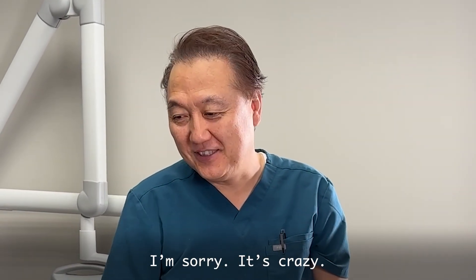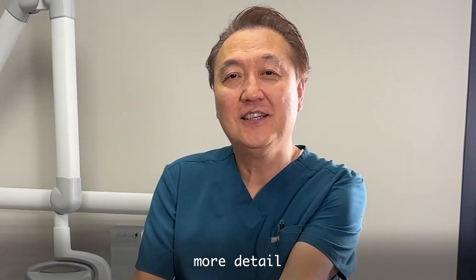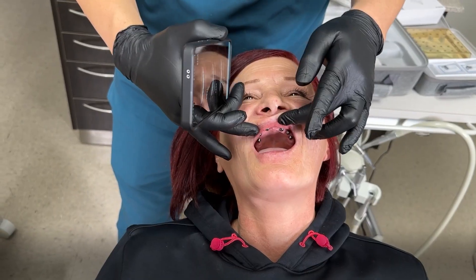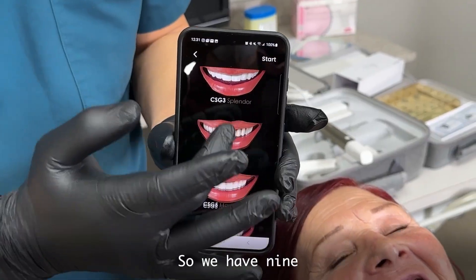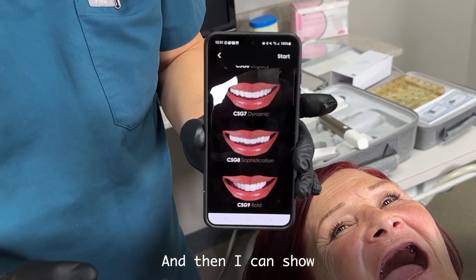How many implants? Six implants. So we're going to show you a little bit more detail. It's a nicely placed implant — it's awesome. She can utilize the guide for which tooth shape. We have nine unique different shapes, and I can show how to do it.